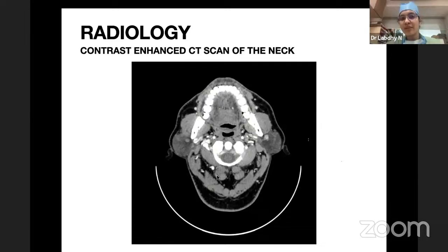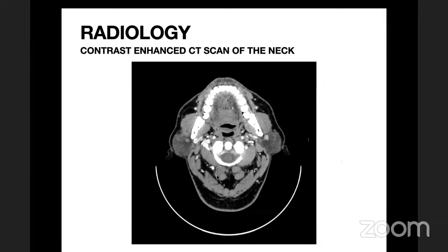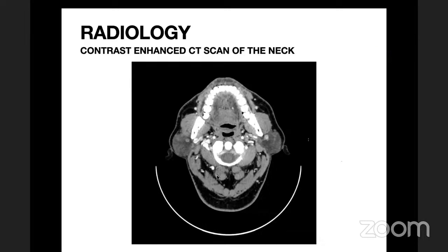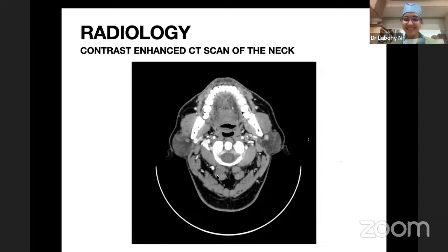Grades 1 to 3 suggest a benign lesion, whereas grades 4 and 5 point towards malignancy, and NBI-guided biopsies have a better yield as well. Okay, good. Forget the grades. Is it the longitudinal capillary loops or vertical that are more dangerous? The vertical ones. Okay. You're using common sense or you read? Okay, go ahead.